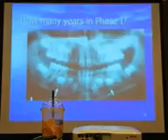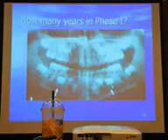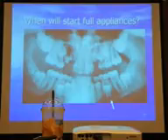So if we start analyzing, here we see the crown. Root is starting to form, but just starting. So here we have somewhere in between 3 and 4 years, closer to the 4 years. In here, you see 1/2 of the root is formed. So if 1/2 of the root is formed, how many years do we have? 2 years, perfect, 2 years.